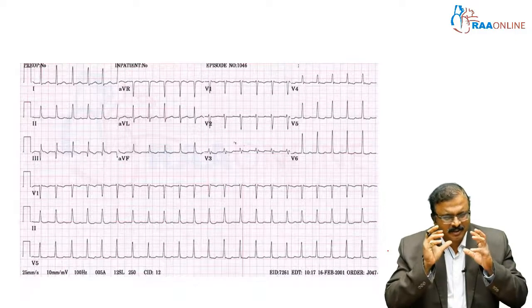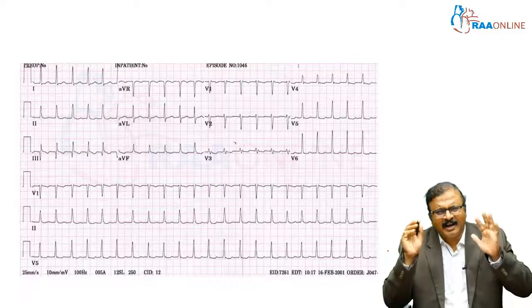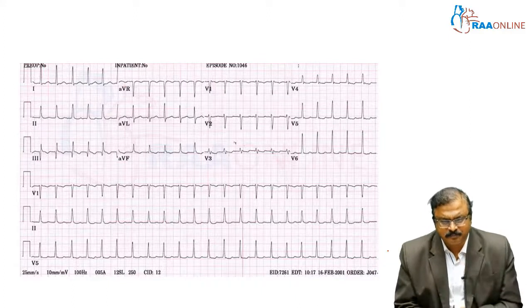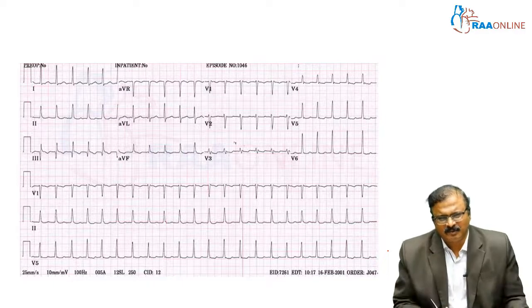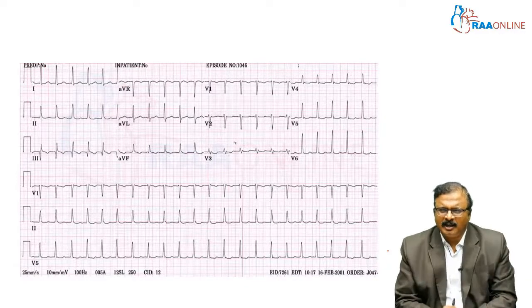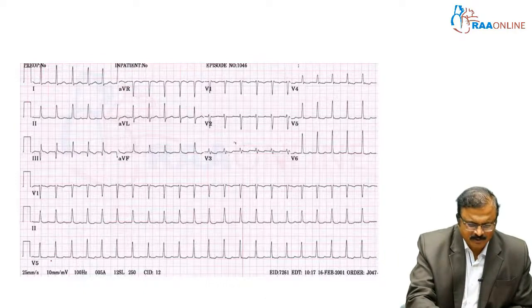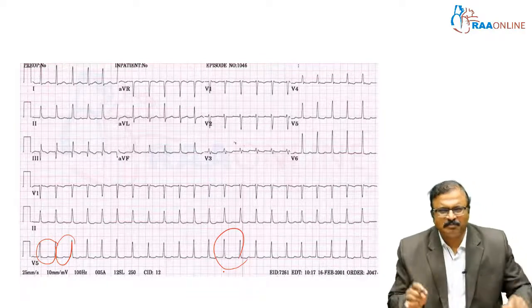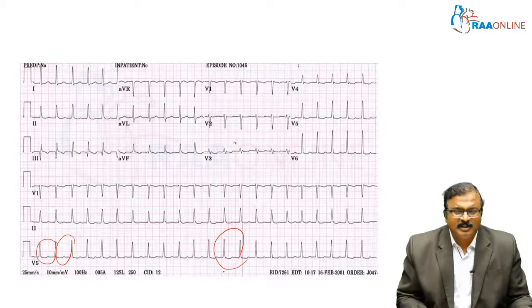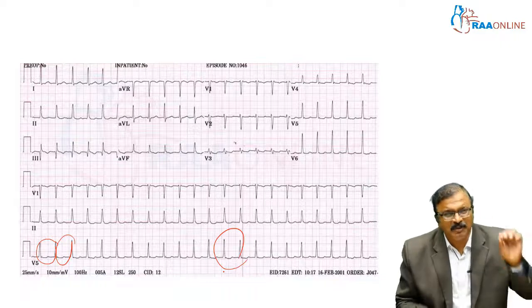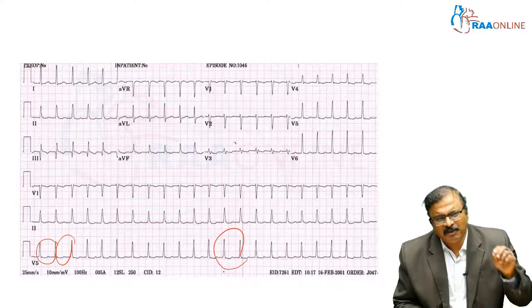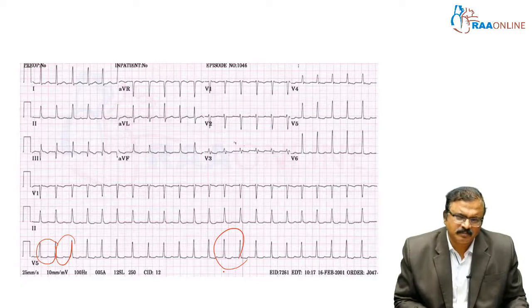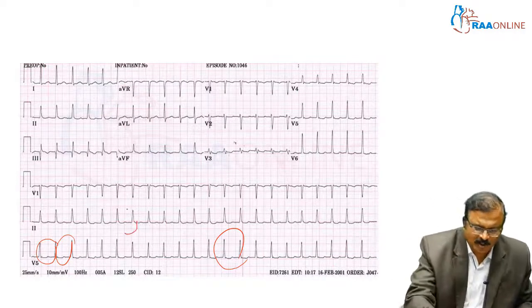Observe this ECG carefully — there is definitely a tachycardia that needs careful observation. The first point is whether it is a regular or irregular tachycardia. If you broadly assess, it seems to be a regular tachycardia, though you can see some variation. Next: whether P waves are present. There are no definite P waves.